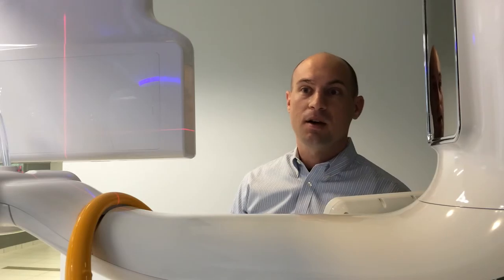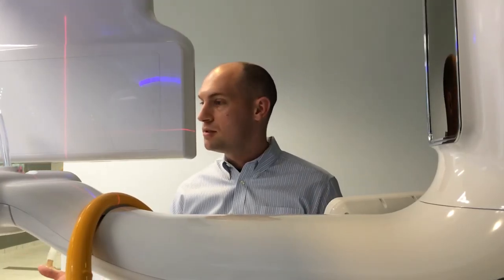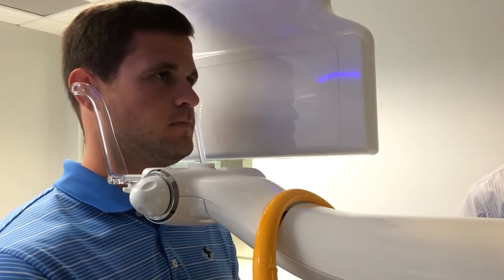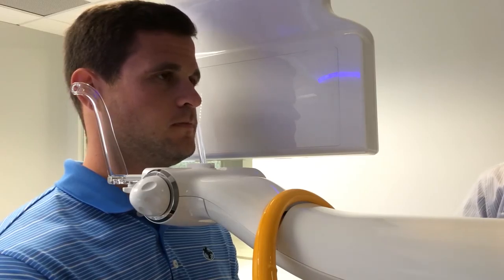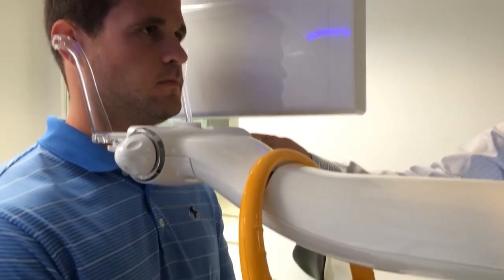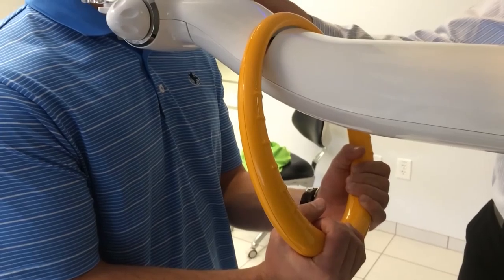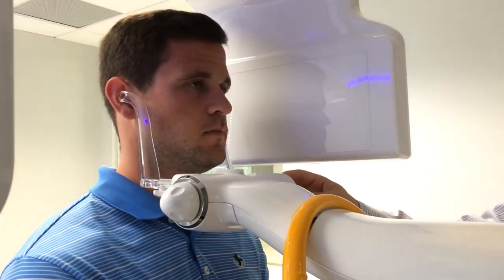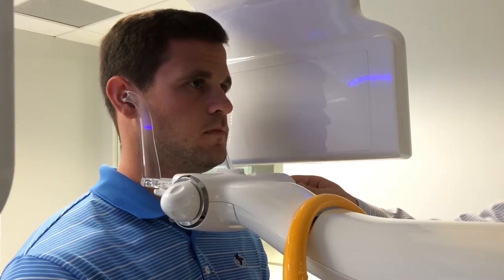Now we're going to position our patient in the RayScan Alpha for our 2D TMJ acquisition. I've replaced our temple supports with the special TMJ supports and removed the chin rest. JP, if you would step forward and step into the machine, please place your hands underneath the chin rest with the orange-yellow ring. I'm going to turn the temple supports in so that the cones on the temple supports go in your ear to put you in the proper positioning. Is that comfortable?